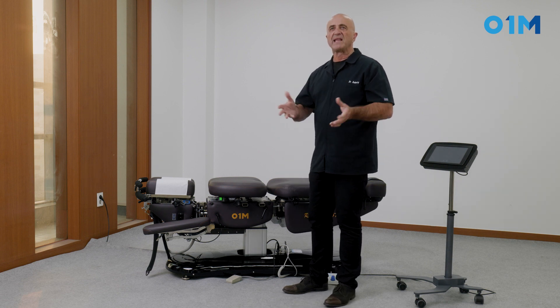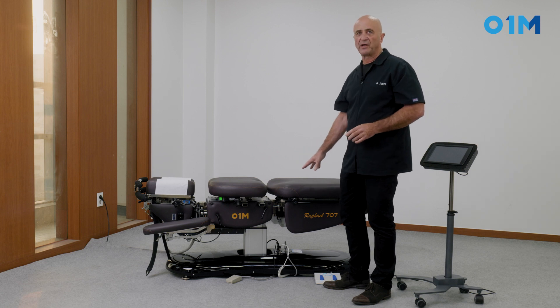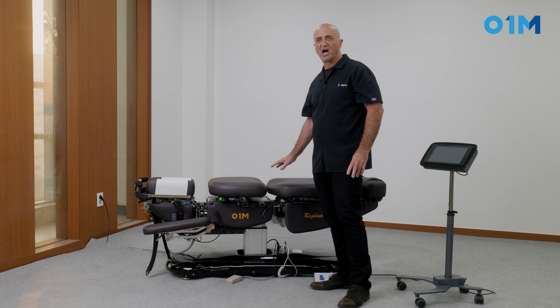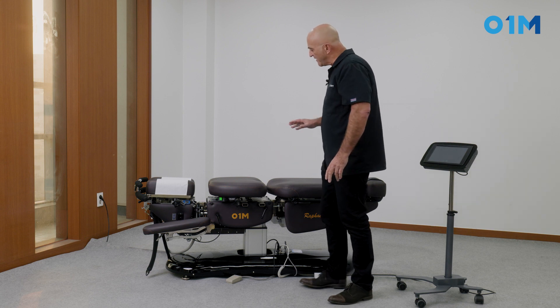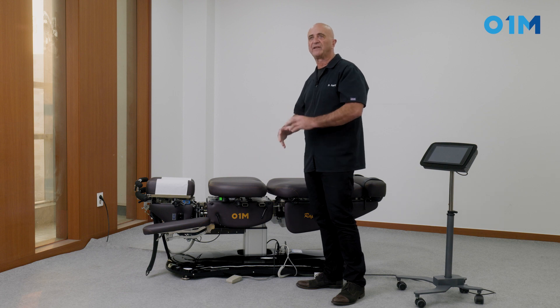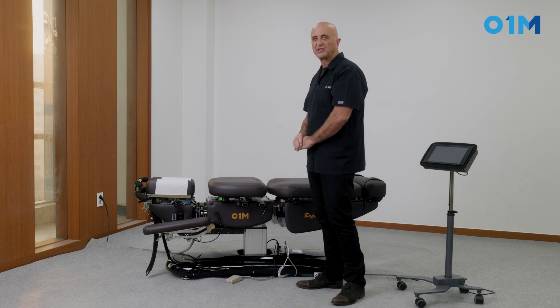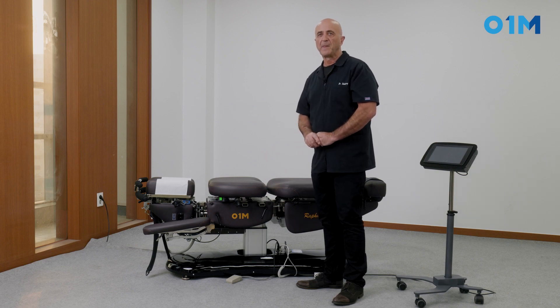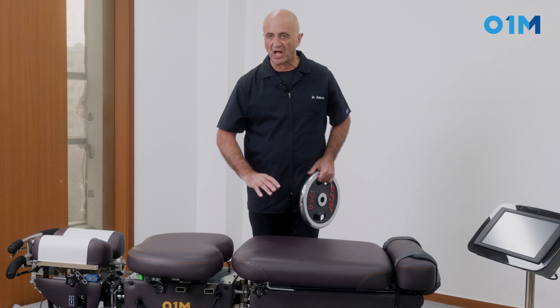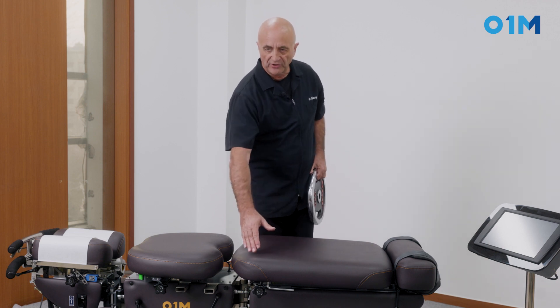The mechanism behind a sustained drop: usually one anatomical piece is a little higher than the other, and you give a momentum to that piece, creating a shearing between two pieces. That's essentially how the sustained drop works.